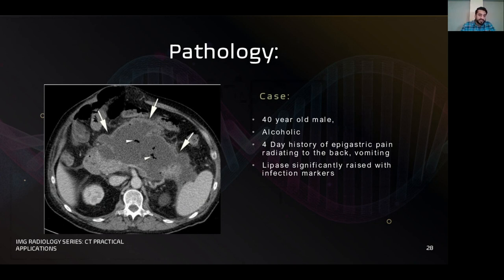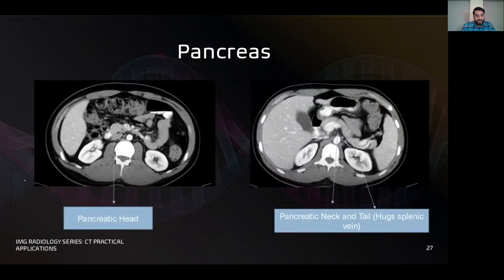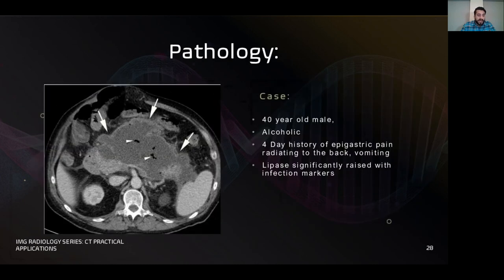So in this particular case, once again, you can see some hypodense and massive irregularity compared to the structure that we saw before, which looks normal here. And this is actually forming, or in the process of forming, what's called necrosis. So this is basically necrotizing pancreatitis, and it's forming a wall. So it's walled off necrosis, but this is all massively inflamed and dying tissue of the pancreas.